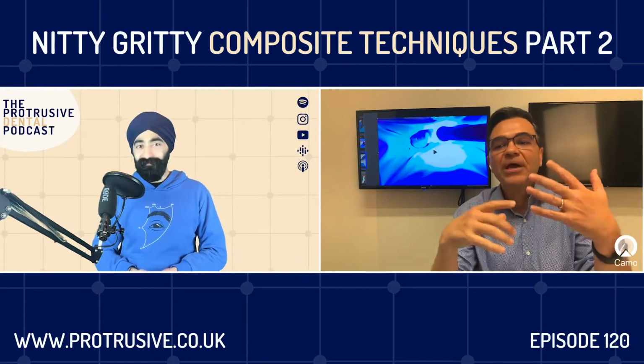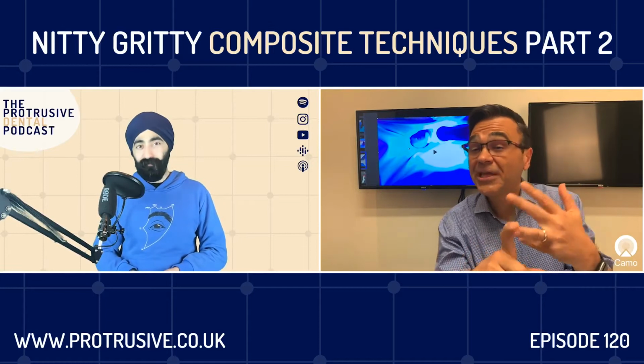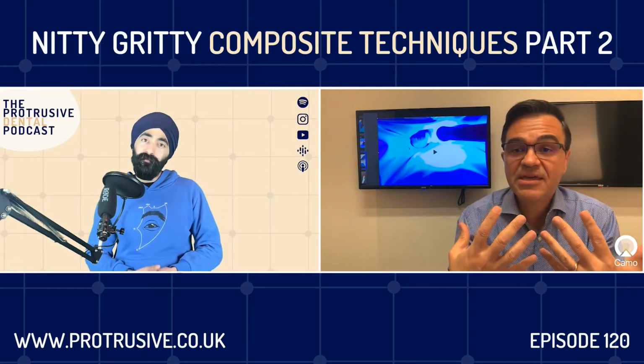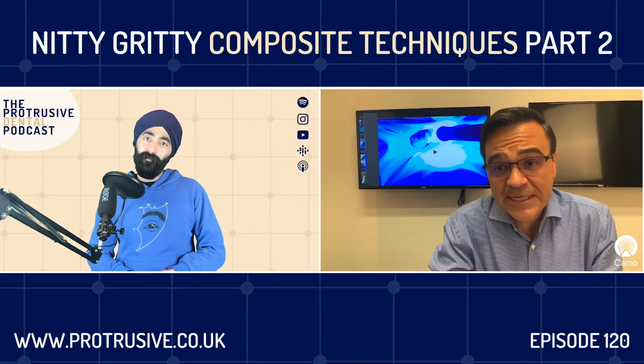and it's going to give you a much more color stable composite veneer, but it also is going to give you a tight contact, so you will not get food in between your teeth. I mean, that's the best way to do it, and it's called the Mylar pull technique.